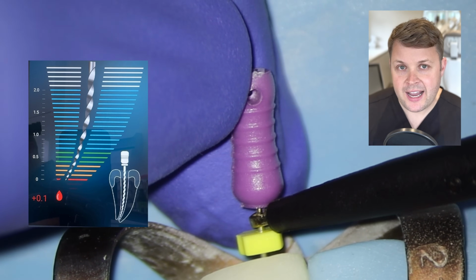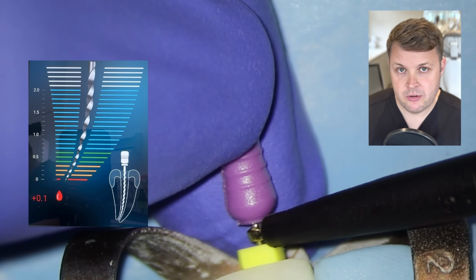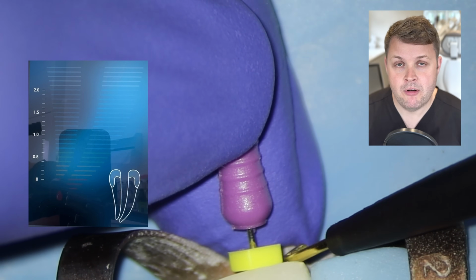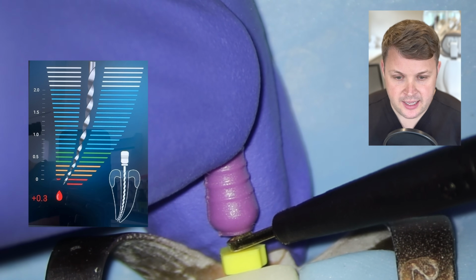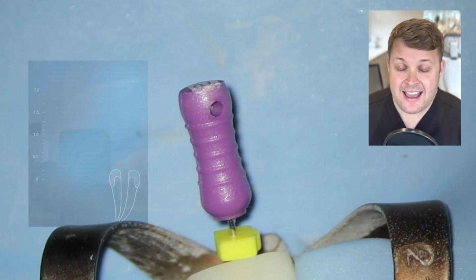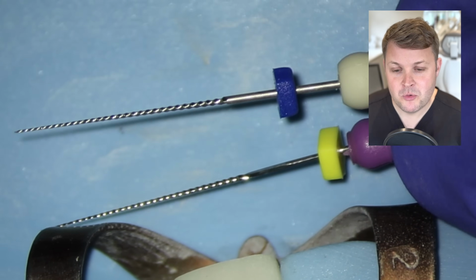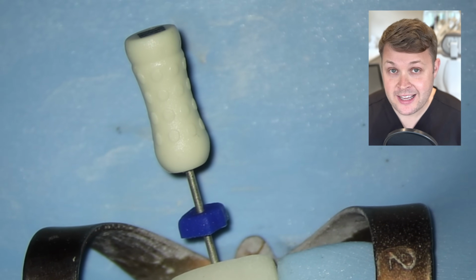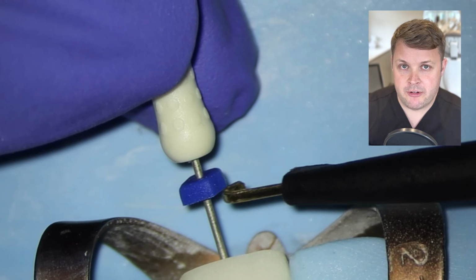What I do in these situations is, if the size 10 is not giving a great reading, it's because the file is too narrow for the opening. So I'm going to flick the size 10 K file out, and I'm going to use a size 15. In fact, the evidence suggests that using a size 15 is more accurate for working length measurements. And when we hook up the apex locator to this size 15 K file, we've got that more accurate and controlled reading.